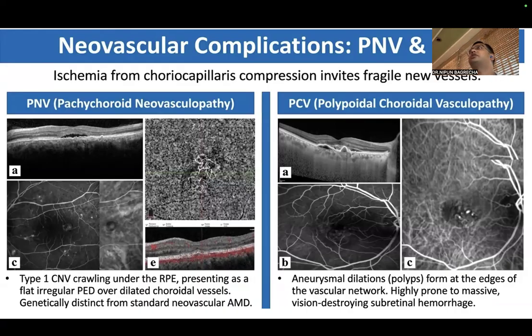I want to ask Dr. Shreya: for polypoidal choroidal vasculopathy, as it is a choroidal pathology, what is the gold standard for diagnosis? And if that modality is not available, how can we diagnose it on the OCT?